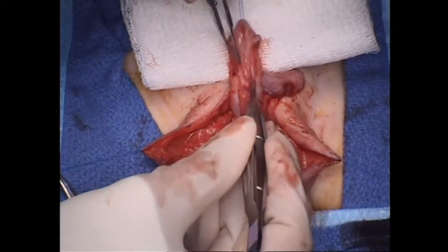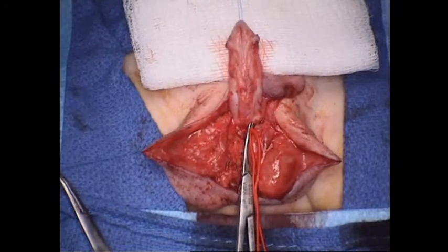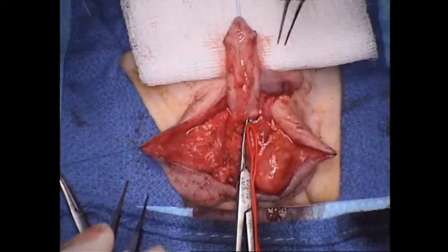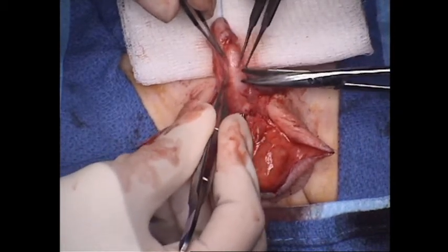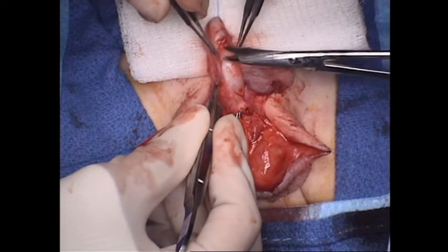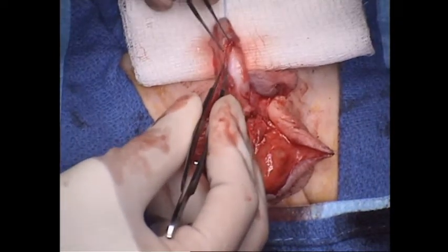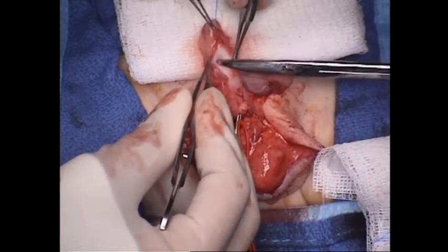So, now that we've ruled out all the dartos tissues as the cause for a curvature, the next step is to rule out our urethra and our urethral plate as the cause for our curvature. So we're going to dissect under the spongiosum and mobilize this urethra with our plans to transect the urethra in just a moment here. So there's a nice bloodless plane, of course, between the spongiosum of the urethral plate and urethra and the corpora. We're going to dissect right underneath there.